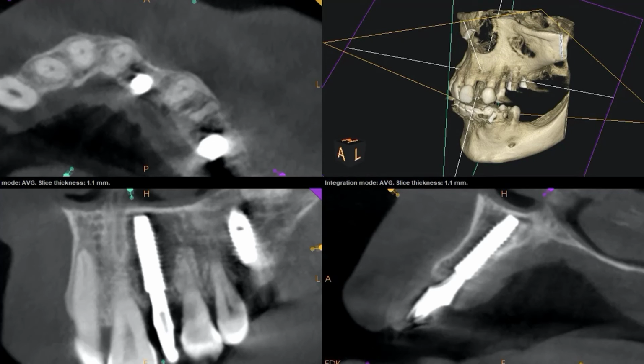Really happy with that. You can see the abutment is nice and seated there. Overall, I think it went really well. I can't get over the fact that the patient was in the chair for maybe 15, 20 minutes. And we can put an implant in and immediately put in an abutment that fits with the orientation of the implant, and then a crown, a PMMA milled temporary, that fits without any proximal adjustments. That's just remarkable. That's a nice complement to a really accurate workflow.